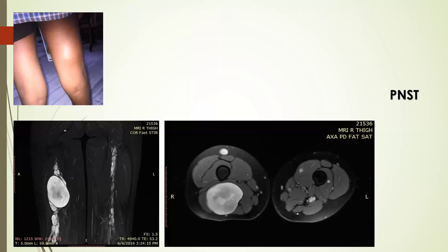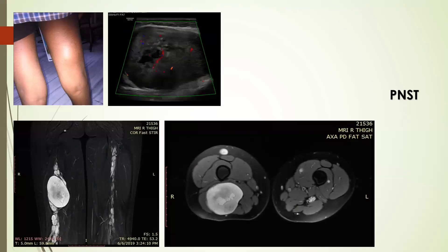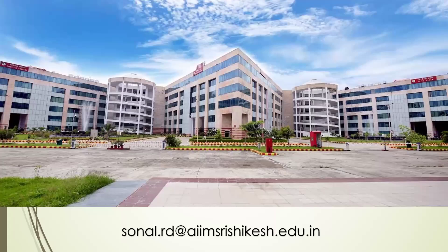Another case of neurofibromatosis type 1 shows a large nerve sheath tumor along the course of the sciatic nerve, which is also thickened bilaterally. The ultrasound image demonstrates internal vascularity, consistent with a peripheral nerve sheath tumor. These are the common pathologies detectable on ultrasound in the region of the knee. Thank you.